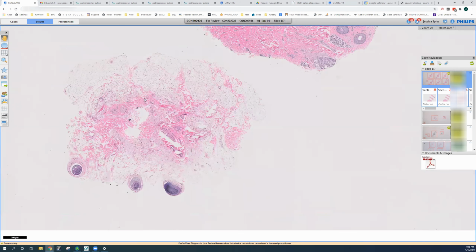So here, we can see that we have a very low follicular density. Normally in a 4 millimeter punch, we would have probably at least 40 hairs to look at, and we have only a handful here, probably 10 or 12 follicles to look at. So we've got a decreased follicular density. And then a lot of these follicles are in catagen or telogen phase. So this is a catagen telogen follicle, we would say, because it's got this stellate outline. We have another one here.